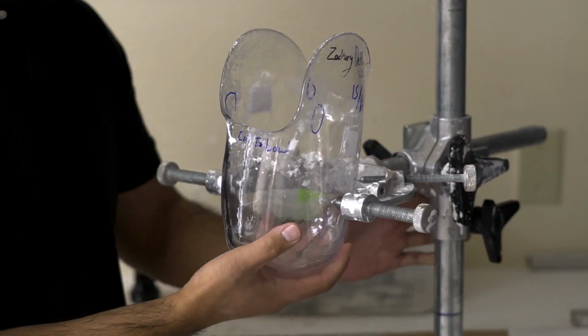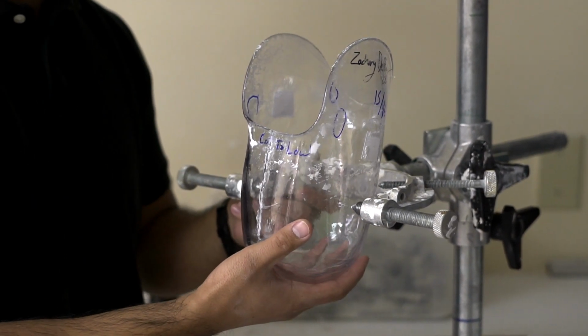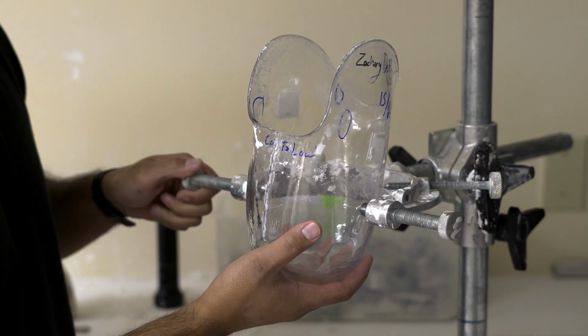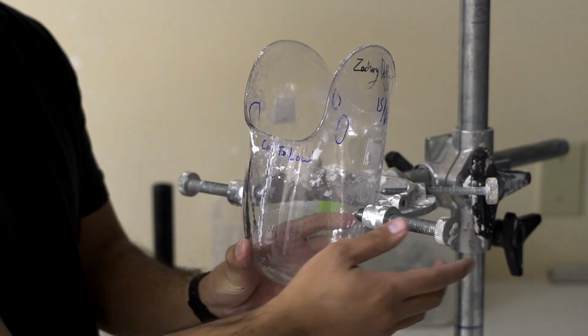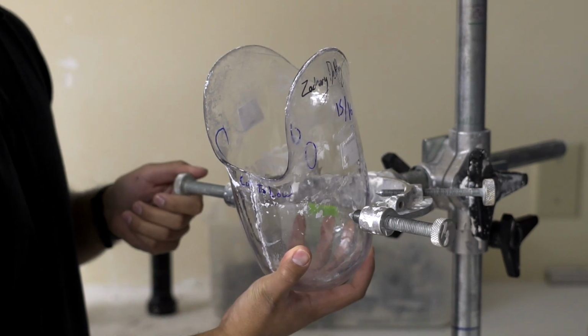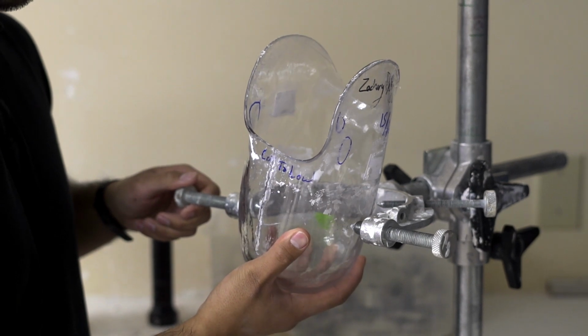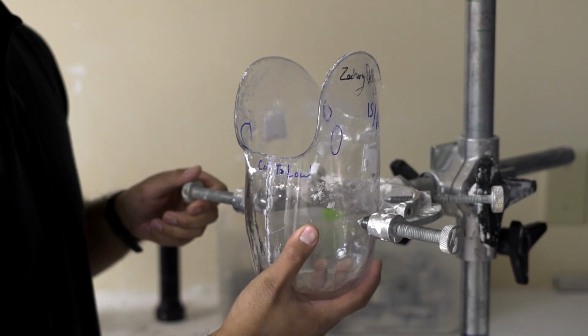And if you need to put some knee flexion into your check socket, all you need to do is loosen these screws in the front, and you can set it into knee flexion, knee extension, and also adduction and abduction.